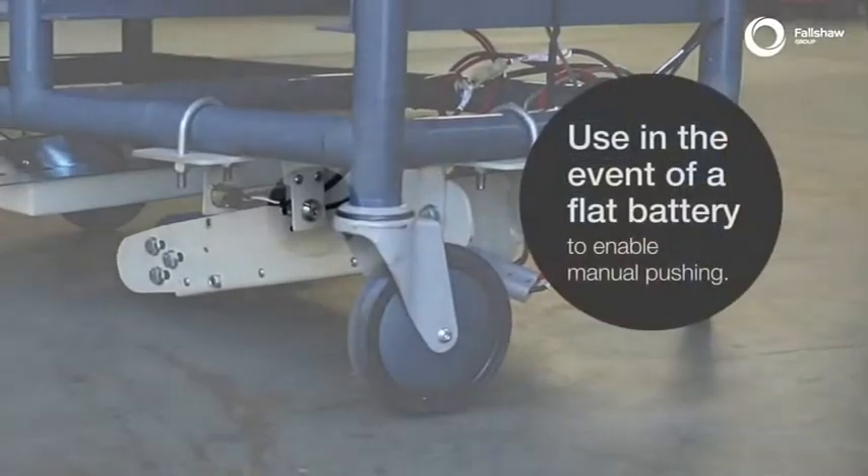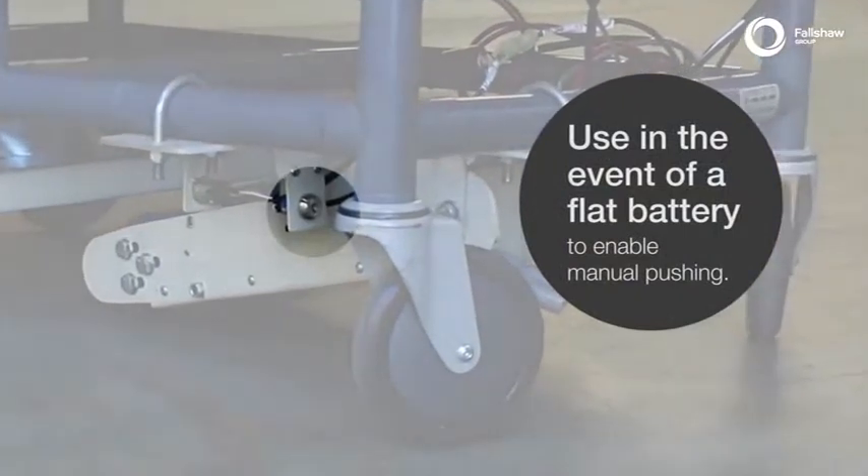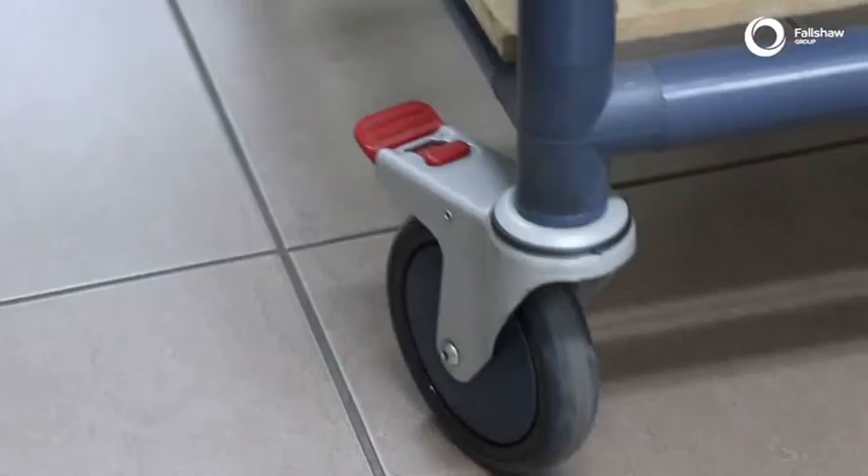The brake release switch releases the brake when the unit is powered off and can be used in the event of a flat battery to enable manual pushing.